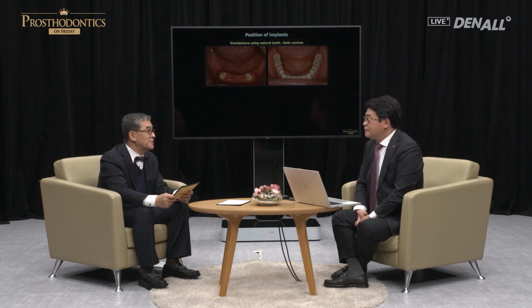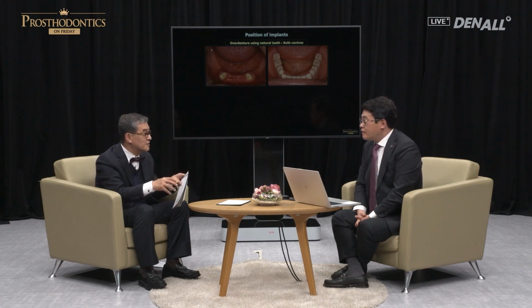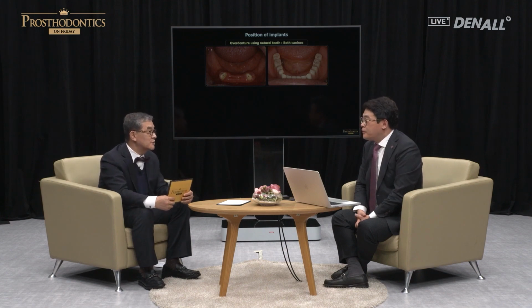Doctor, it was in your slide, and you talked about the canine. In the case of V shape, you mentioned that it is better to place it in the lateral incisor. In general, dentists prefer to place it in the canine because there's the oval type or square type rather than the V shape.